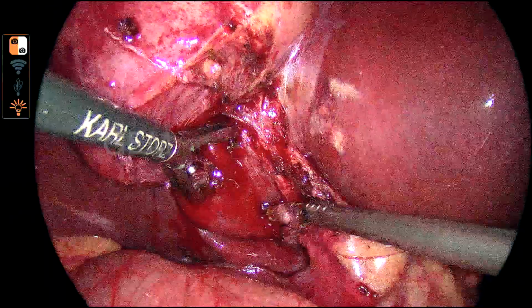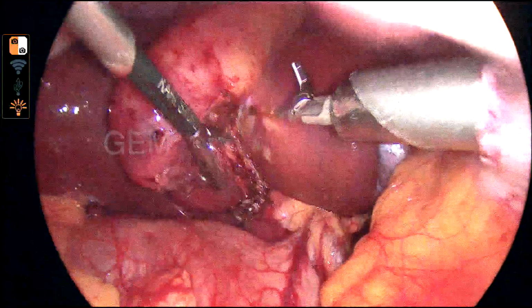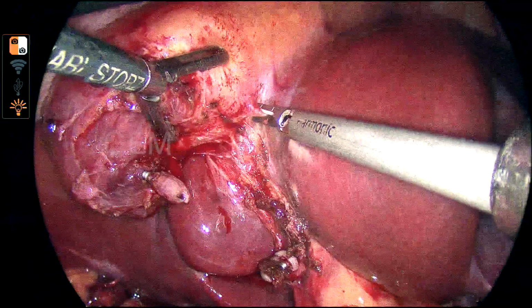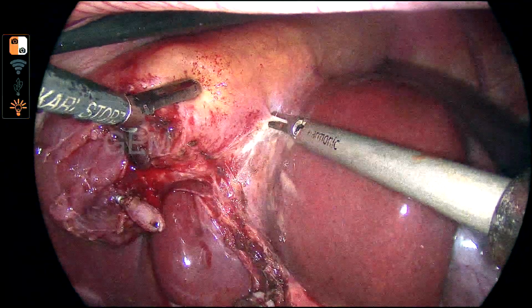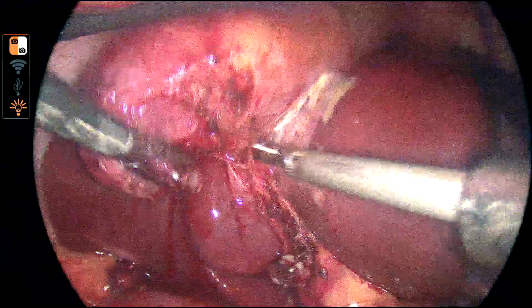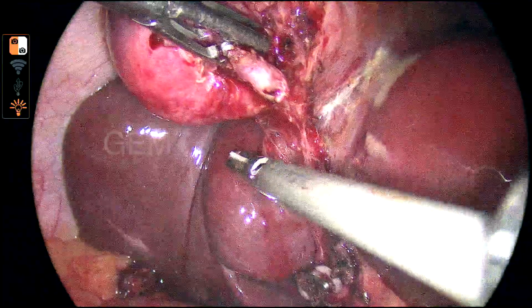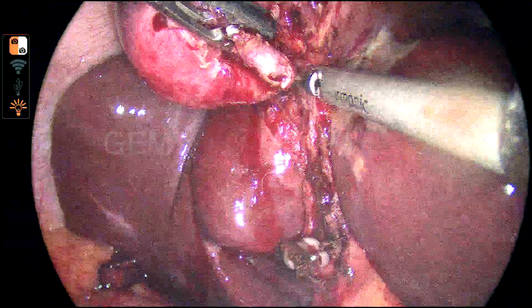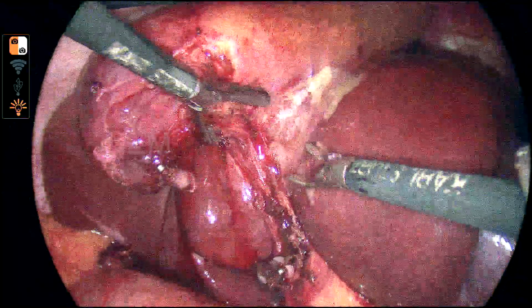Now you can see it is facing laterally, that means it is safe. And I am checking the posterior cystic artery. If a posterior branch of the cystic artery is there, I have to coagulate or clip. Normally I don't put an energy device on the posterior cystic branch, and my preference is clipping because of the high pressure on the posterior cystic artery. So even with harmonic or ligature, I don't use it; I put a clip and then I divide the artery.